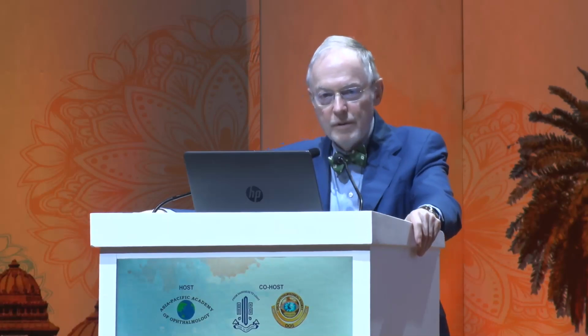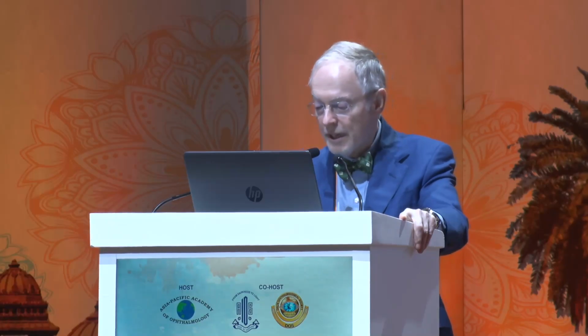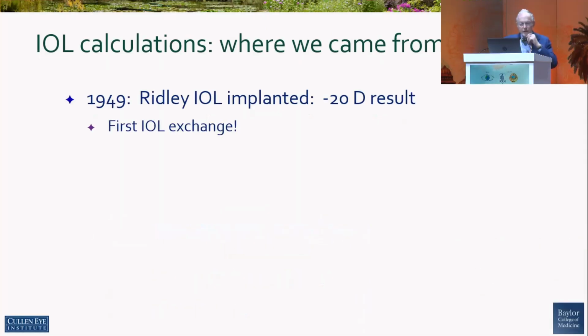You have heard several excellent talks. I could almost just sit down because everybody did such a great job covering the topics, but I'll go ahead and talk a little bit about it. It's interesting to think of the history. The first IOL was in 1949 when Ridley implanted it, and that patient came out minus 20. So he had to do an IOL exchange. So that was also the first IOL exchange.